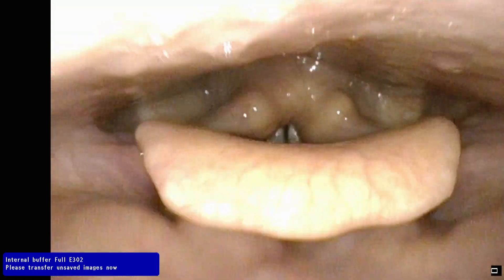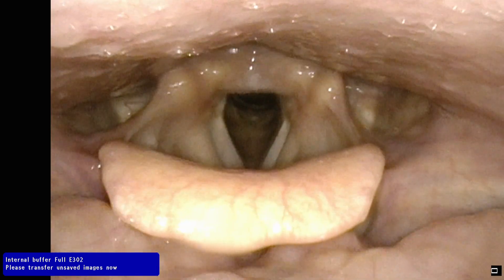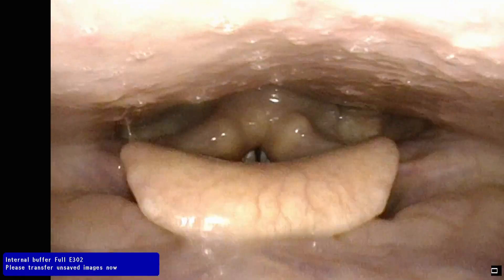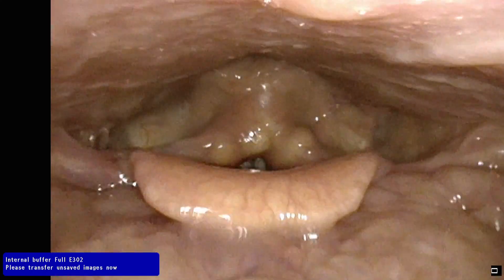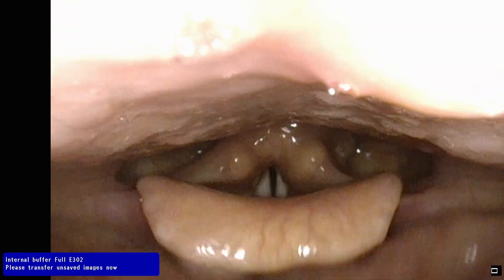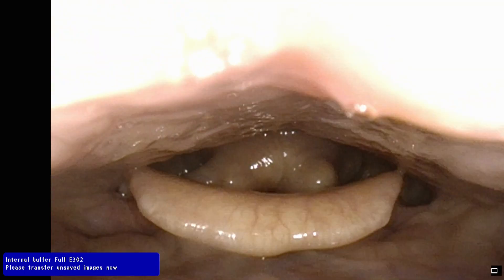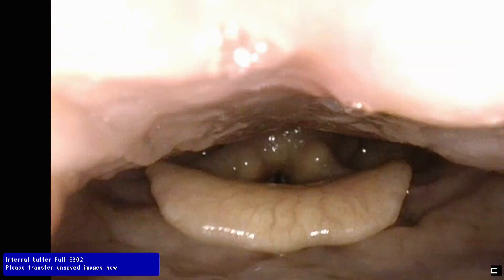Do you want me to try singing something a little harder? No, let's just — so you can see it too. Yeah, pick something harder, like if you want to do something belty or anything like that. I've never tried a belt because that sounds like it would be so painful. I could do like a little vocalise. Okay, let's go. Oh, I see that phlegm, that white color. Yeah, here — let's get a closer look at it. Just swallow. It's probably going to be gone now though.